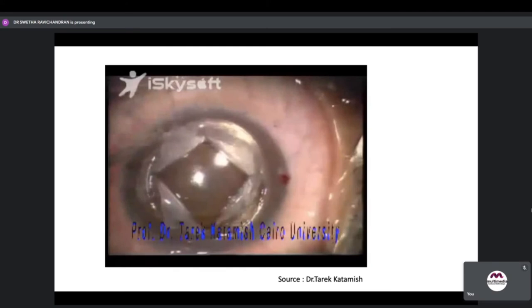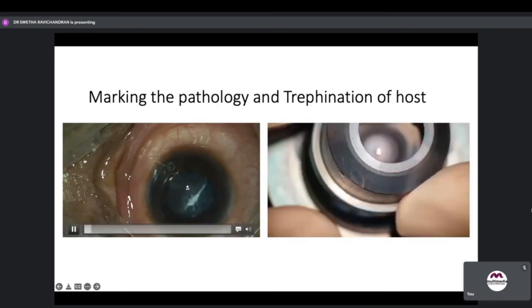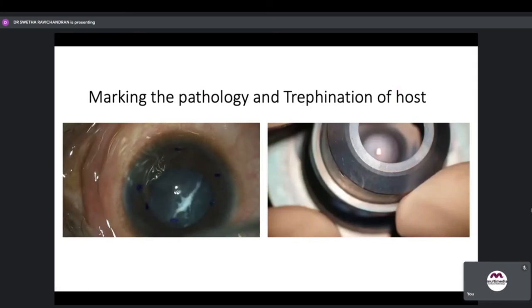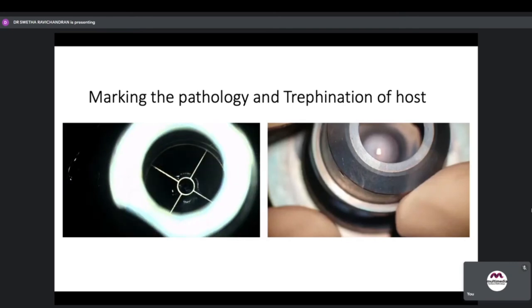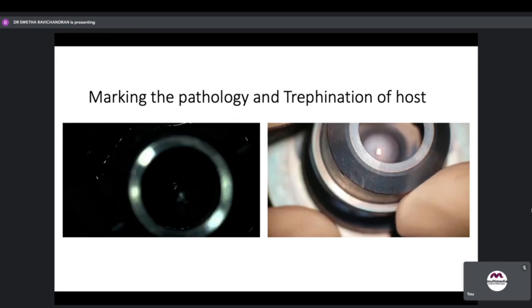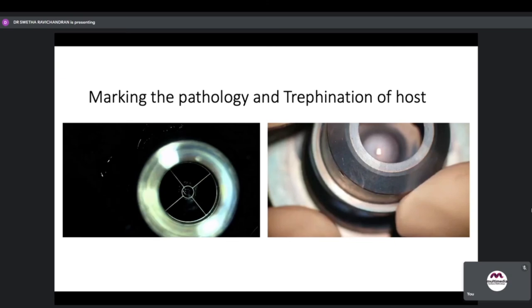Summary of the DALC procedure steps: using the correct speculum, trefination of the host, baring the DM or near-DM, trefination of the donor, and suturing. It is important to mark the pathology, center the trefine, and mark the center of the cornea.